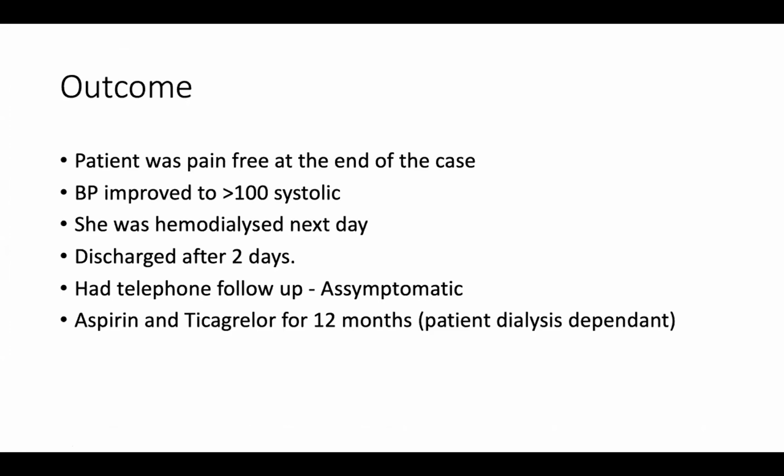The other thing to say is that the IVUS studies haven't shown any downside to leaving malapposed stent struts. This is not associated with stent thrombosis. So we always worry and concern ourselves with trying to expand the stent as much as possible so it's apposed to the vessel wall, but there isn't any strong data to show that increases your risk of stent thrombosis. And there was clearly no way I was going to be able to appose the stent in this ginormous left main stem.